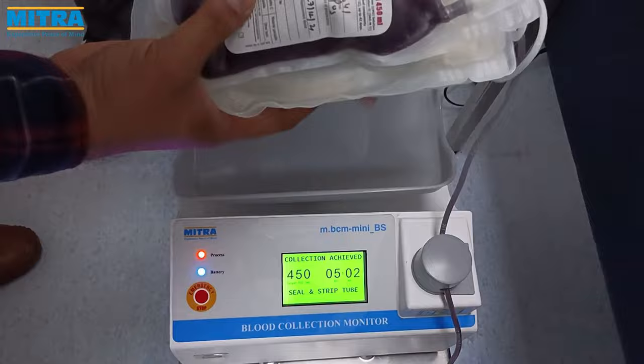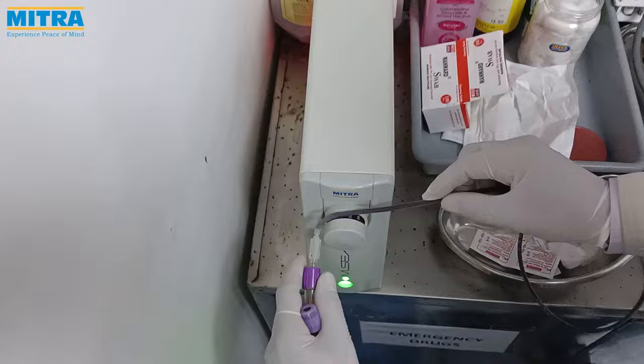Now, withdraw the needle and seal tube after collection of blood sample for testing.